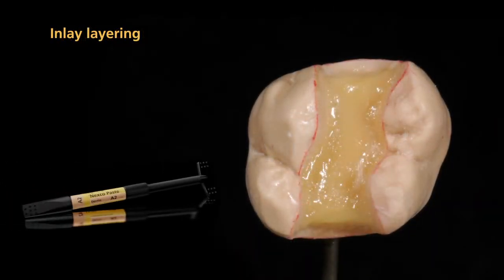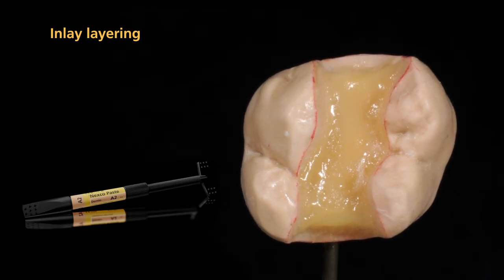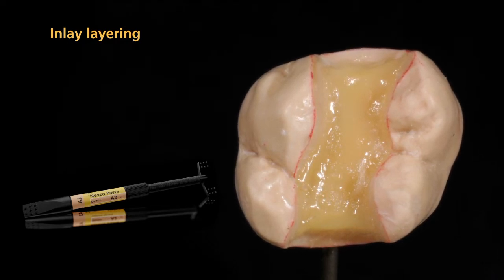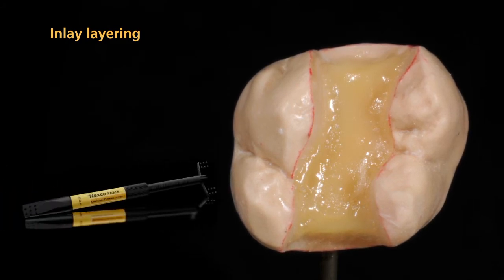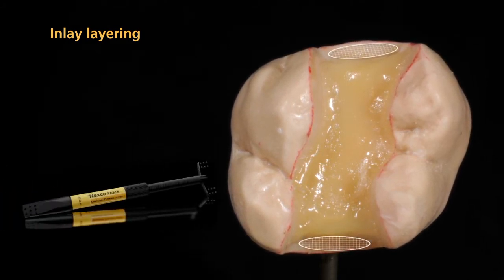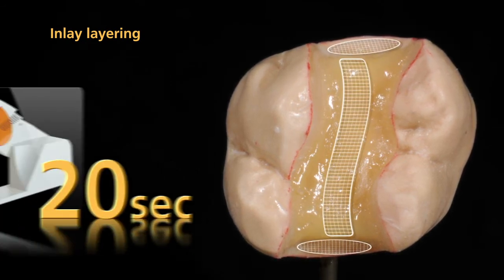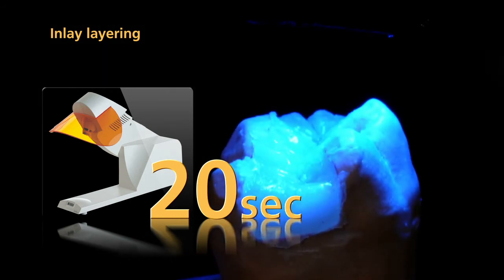Now the actual layering procedure begins. Press the first layer of Nexco paste firmly onto the liner surface to ensure an effective bond between the liner and the composite. To increase the shade effect in the interdental area and cavity, you may want to use occlusal dentin. Then pre-cure each segment again for 20 seconds using a quick pre-curing light.